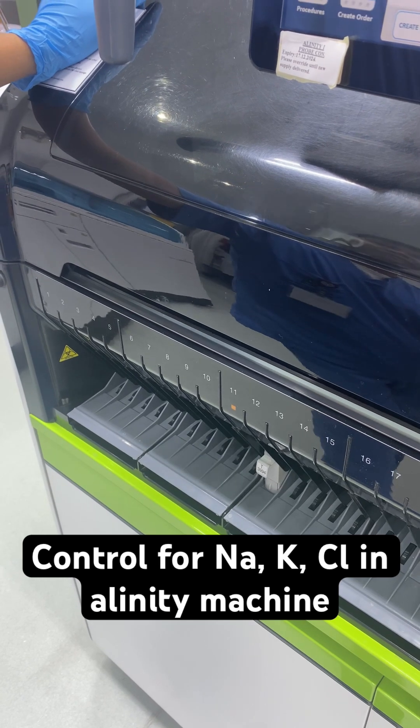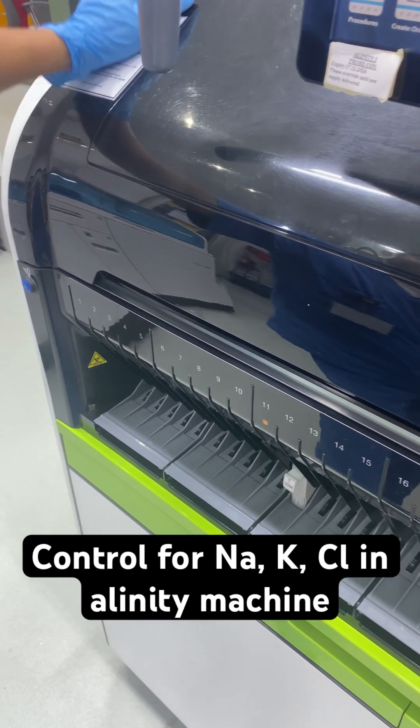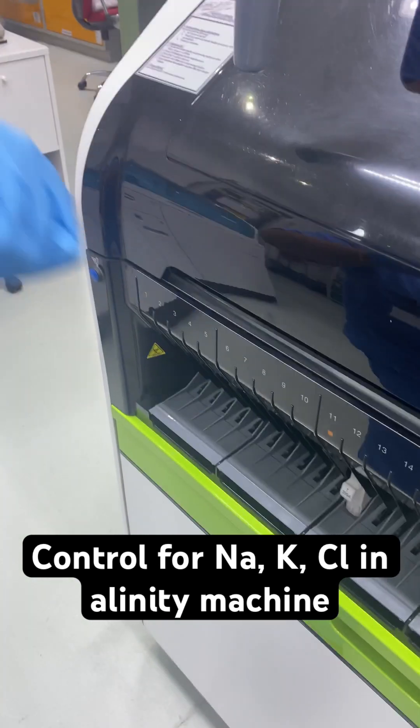It takes about 15 minutes to complete all the ordered tests. Thank you.